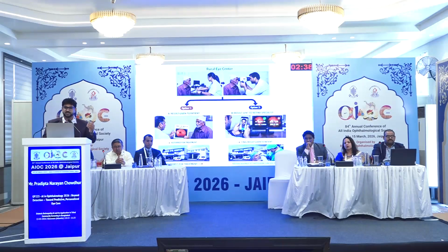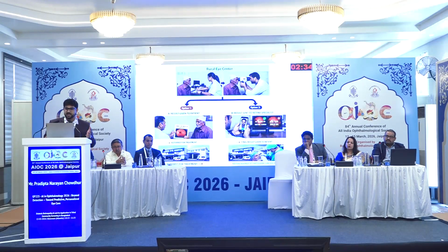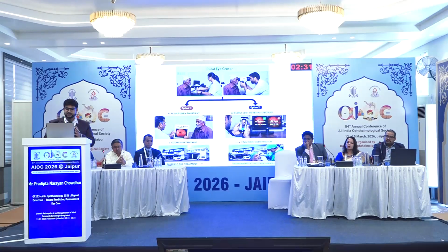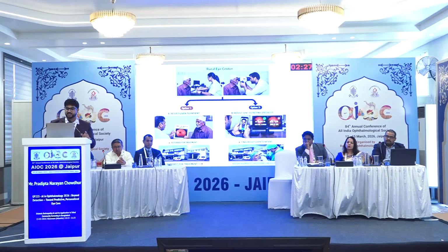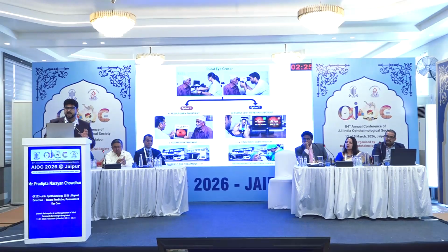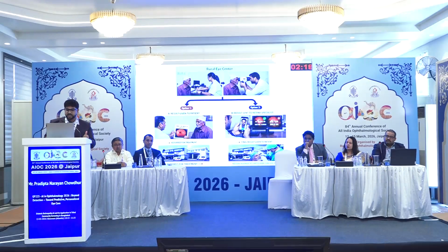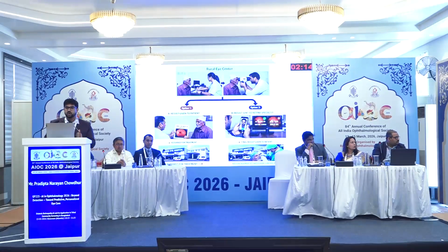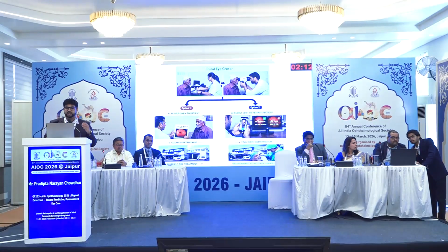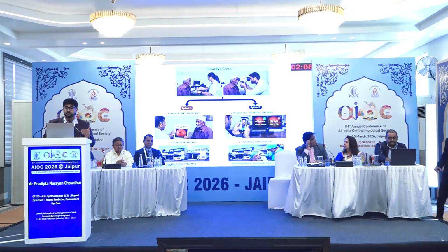So a patient walks into our rural center, we take the patient data, and then we take the image with the portable fundus, and then that image is given to the AI. The AI generates a result. But here's the catch. We wanted clinicians in every aspect of it. So if there's any single doubt about the AI analysis, the technician can escalate it in real time to the doctor in the tertiary hospital, who also has access through the smartphone. So they can see the AI image and they can either override or approve the AI.